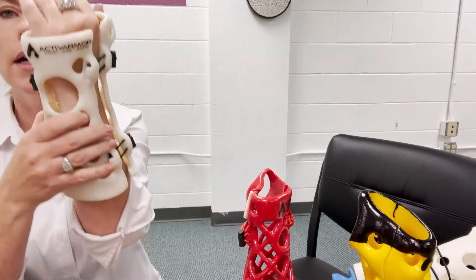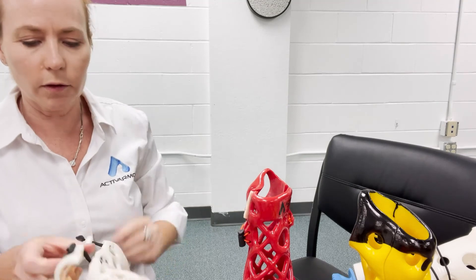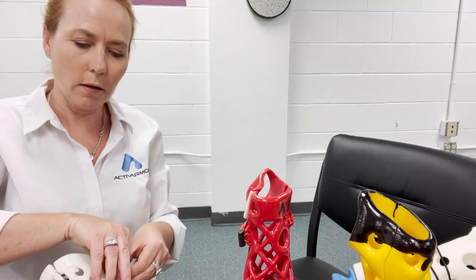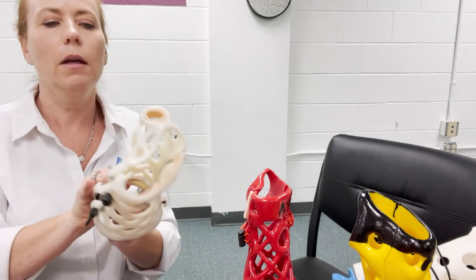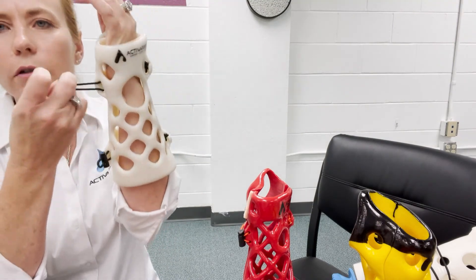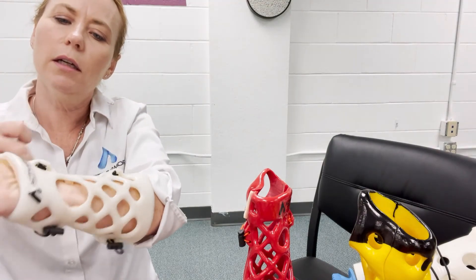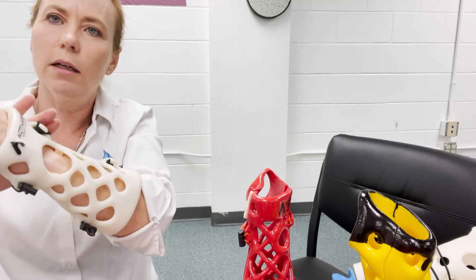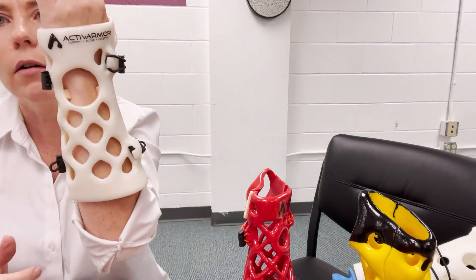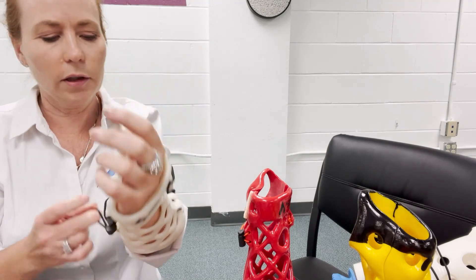Do you see how that is now tightening it up? When I put this on you can see how it's super tightened up in that wrist area — I can no longer move my wrist. That's a really good way to tighten it up.